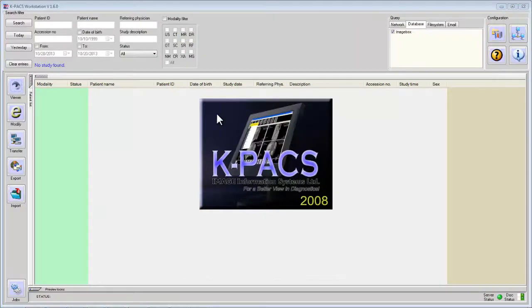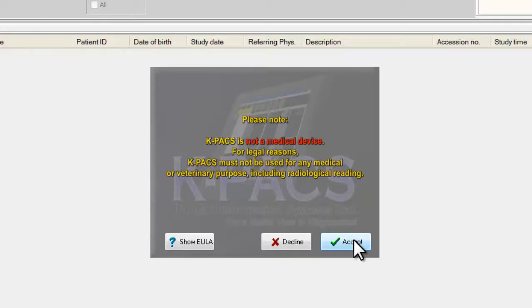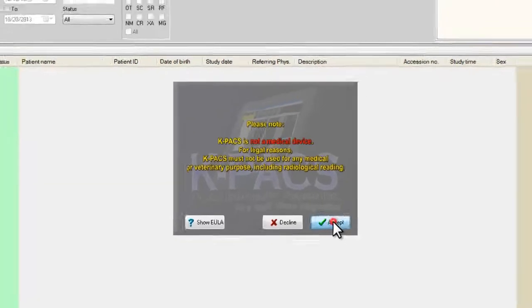I'll get a message from KPEX asking do I accept the terms and conditions of using this software, and I accept it.